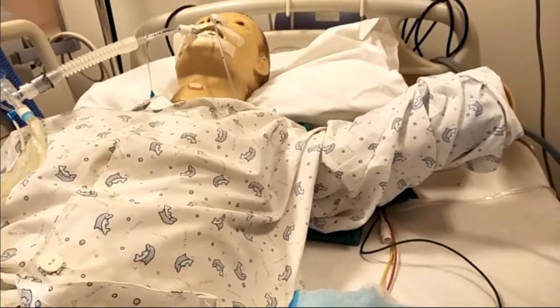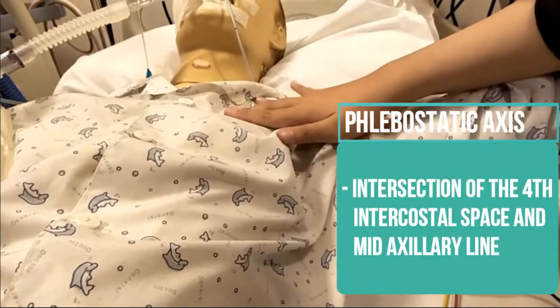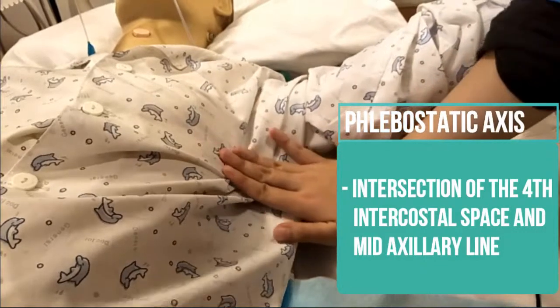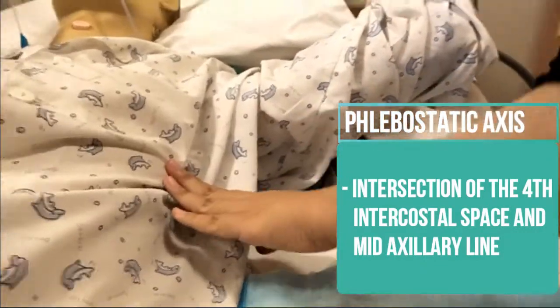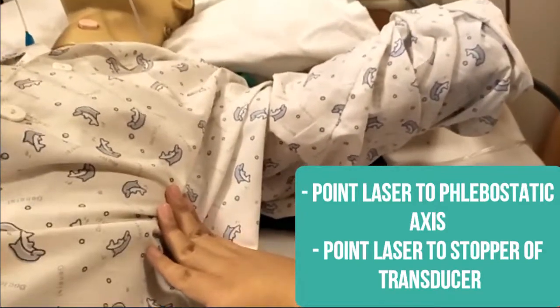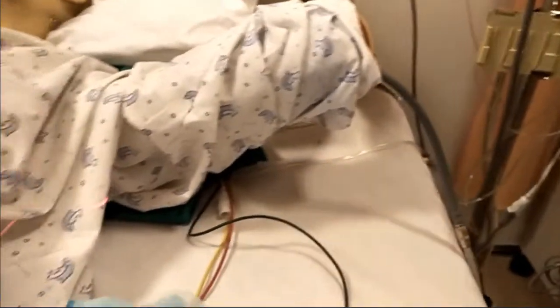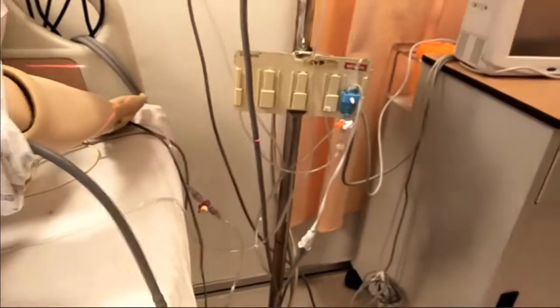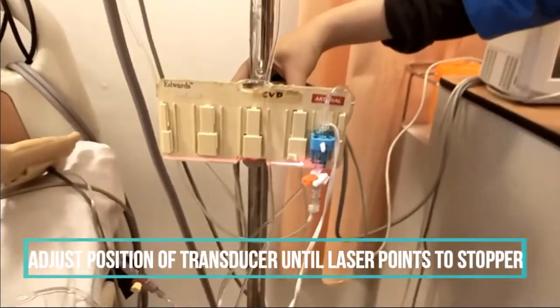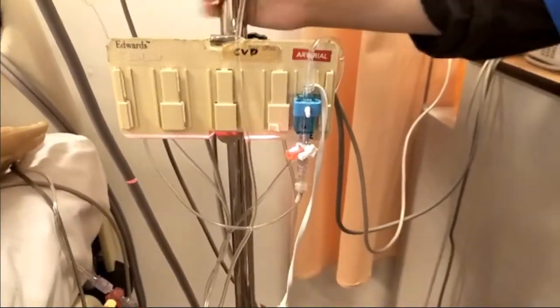The phlebostatic axis is located at the intersection of the fourth intercostal space and mid-axillary line. Point the laser to the phlebostatic axis. Adjust the position of transducer until the laser points to the stopper, indicating it is parallel to the phlebostatic axis.